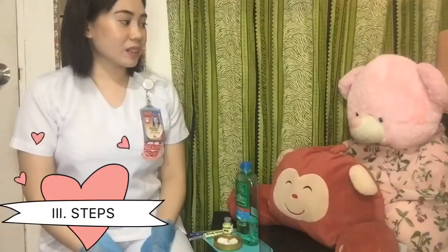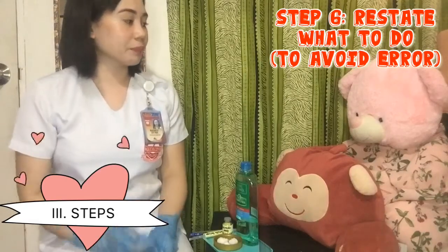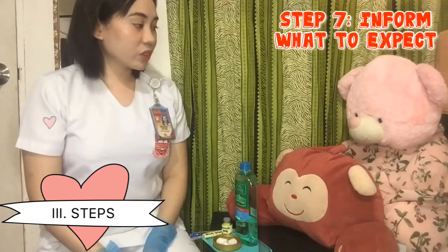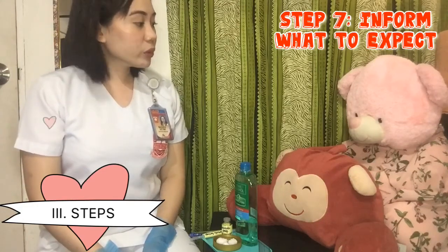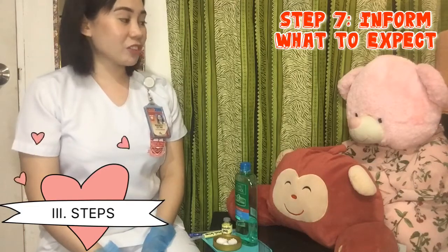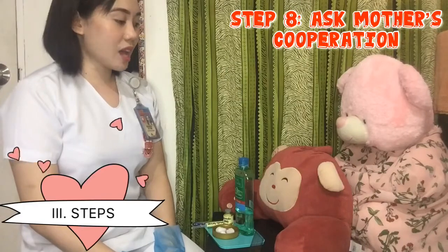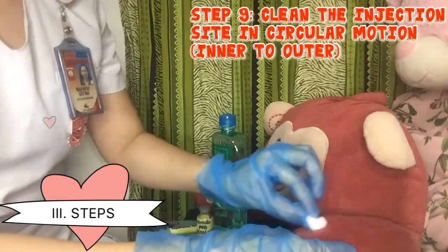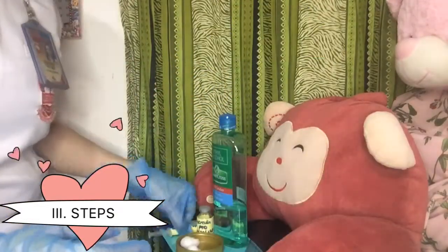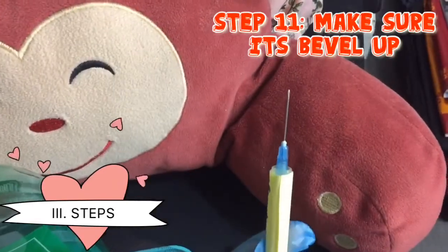Hi, mom. I'm back. I'm going to inject the PPD on your daughter's left forearm. Upon injection, there will be a wheal formation, like the bite of an ant. But don't worry, mom, because that's normal — that's part of the test. Mom, please help me in holding your daughter's hand while I'm injecting.